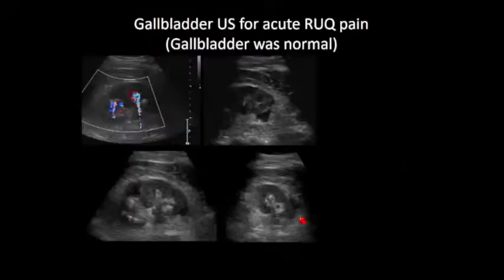So this patient came for right upper quadrant pain. This is one we actually missed. The gallbladder was fine, and duly noted were calculi in the kidney, and that's all that came out of it. Well, if you have calculi in the kidney and the patient has pain, think and look a little bit more. And if you do look, you'll notice there's a little bit of perinephric fluid.